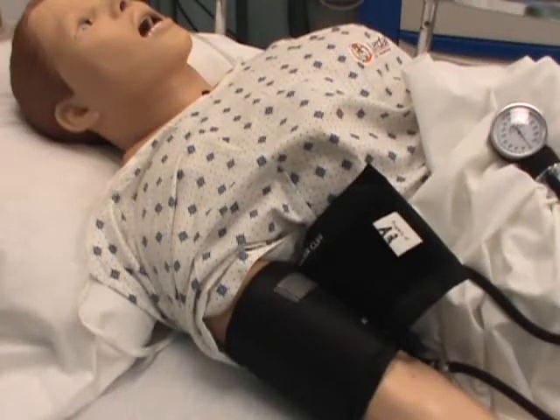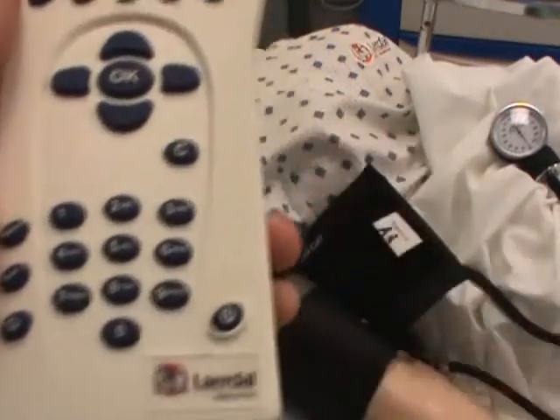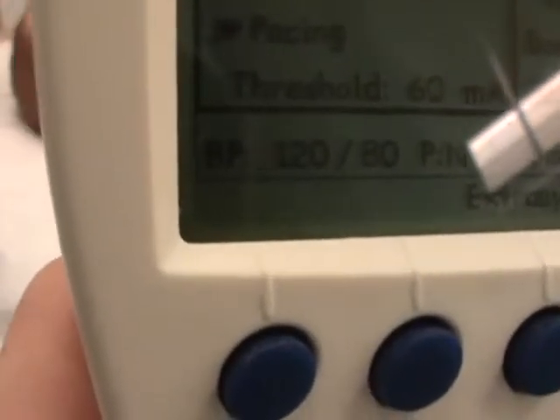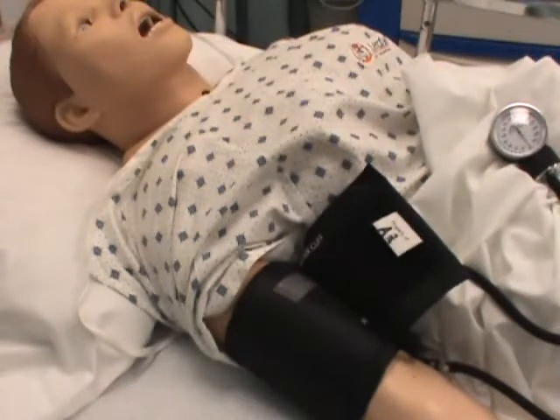Let's talk about programming blood pressures on the vitals in the mannequin. I've turned on my main power box, now I turn on the handheld device, and I get a default blood pressure of 120 over 80. Right now my students could put their stethoscope on the mannequin and practice hearing that blood pressure.